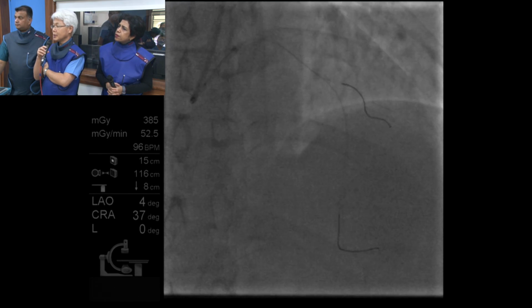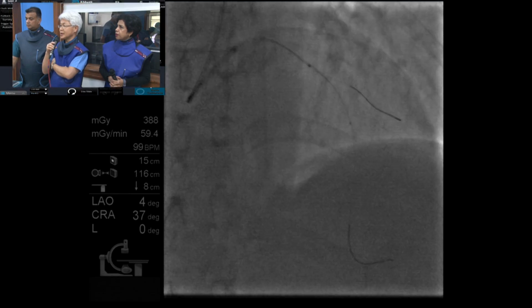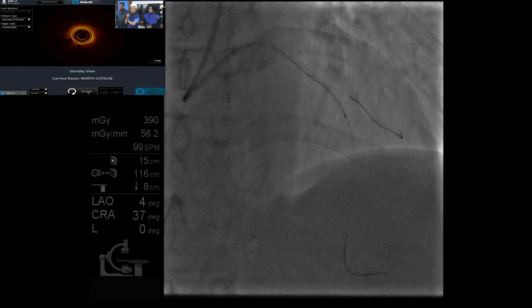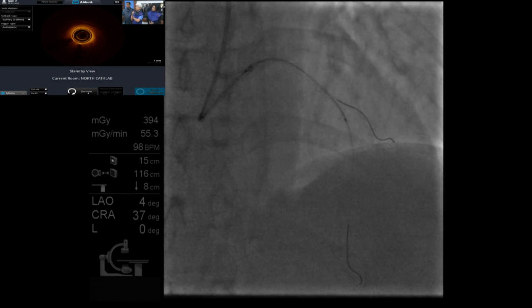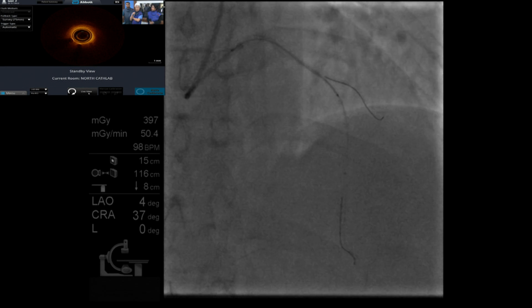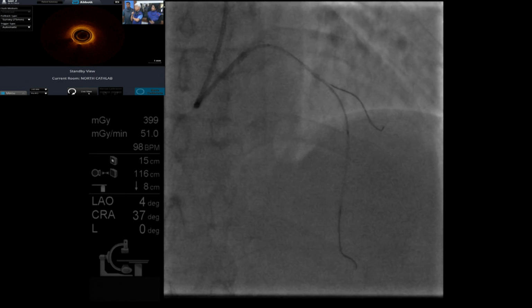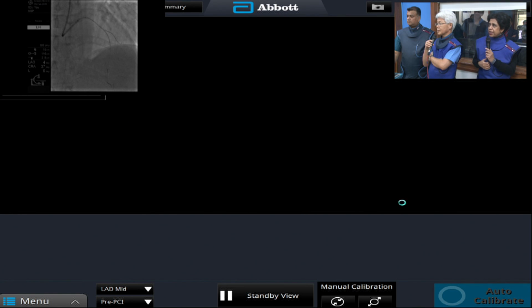Basically, light penetration is a little bit different in contrast and dextran, but clinically not so significant. We can use dextran in daily clinical practice, a great thing for CKD patients.